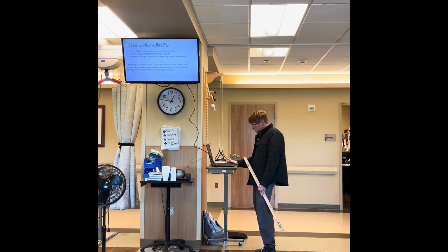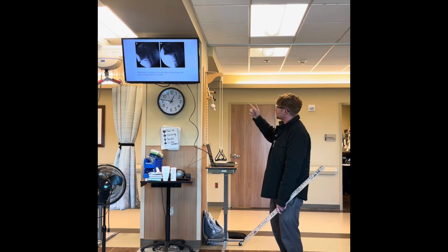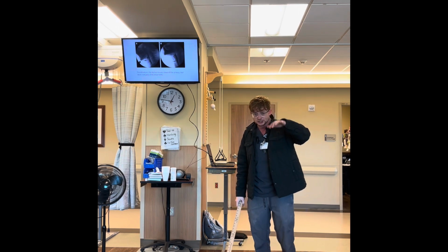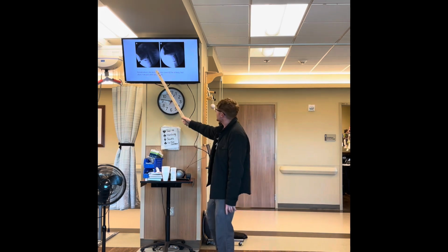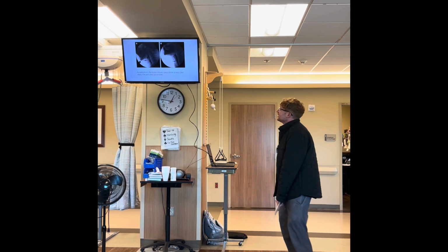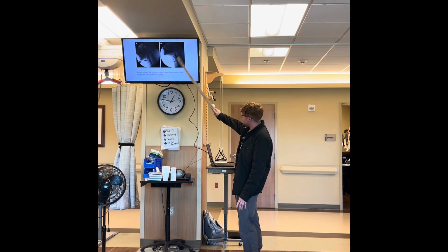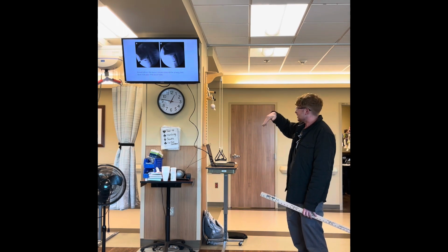That's where the results are. And then, okay, this is where you get, I just said penetration a while ago. A couple examples here of penetration. So aspiration is when it goes into the airway. Penetration is this line. This line right there would be penetration. That's deeper penetration, to where the depth it goes, there's the level and so forth.